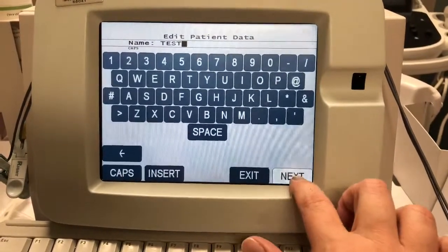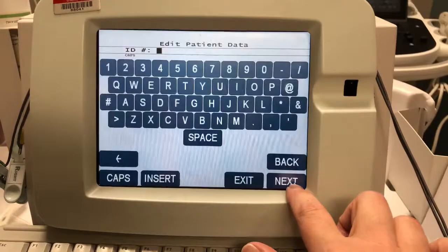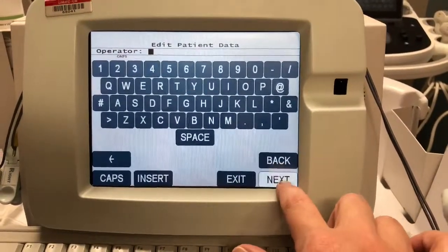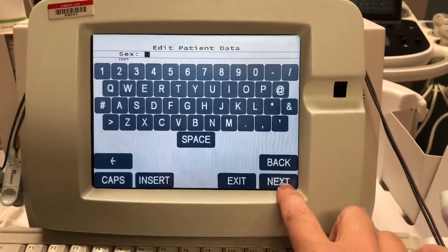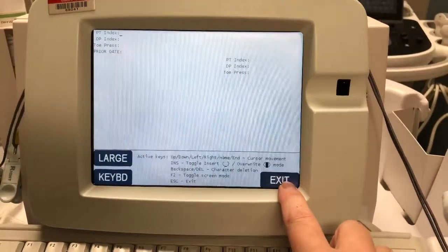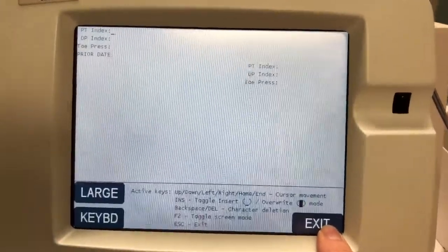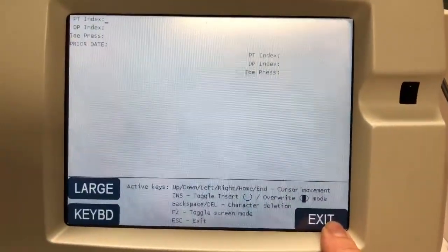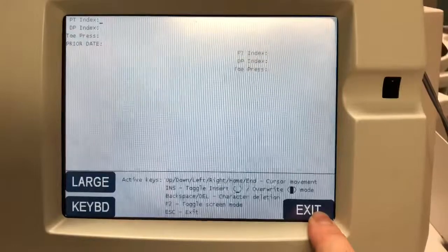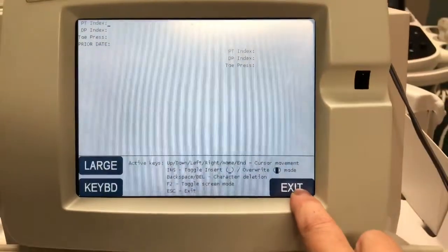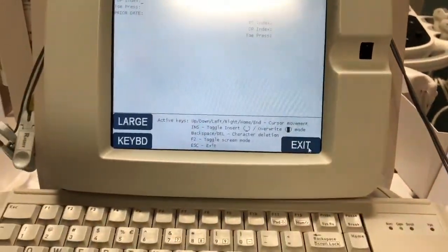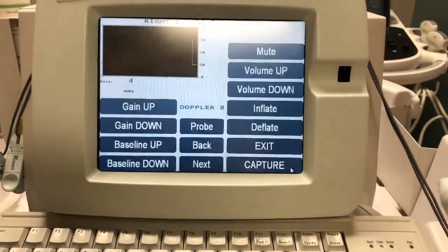Hit next. Their ID would be typed here. This is where you would put the patient's previous numbers if they had had a previous history of having an ABI done, but we're going to enter through those.